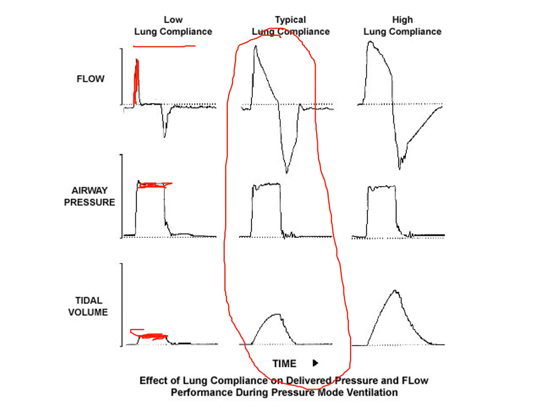So then if you're looking at the high compliance, which shows, again, the same pressure, so how you deliver, you get higher tidal volume. It's very easy to blow this balloon up. It's been used over and over and over again, so it's very easy. So you have an easier flow rate. And again, it's usually due to the overextended alveoli that can hold in more volume. So this is just a little bit of a graph or waveforms to kind of give you a visual as to the difference between how flow and pressure and volume are affected with the different types of lung compliance.